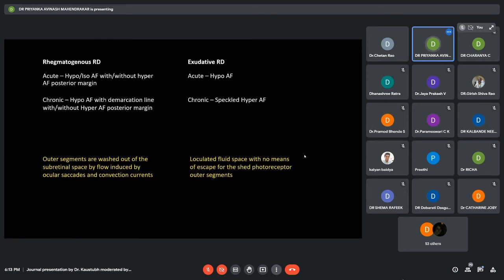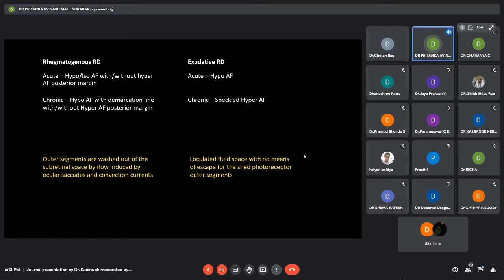Also, there are different autofluorescence features in both rhegmatogenous and exudative RD, although both have presence of subretinal fluid. In rhegmatogenous RD, acute cases, we have hypo- or iso-autofluorescence with or without a posterior hyper-autofluorescence margin. Whereas in exudative RD, acute cases, we have hypo-autofluorescence areas.